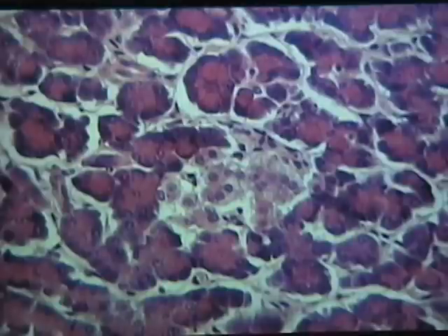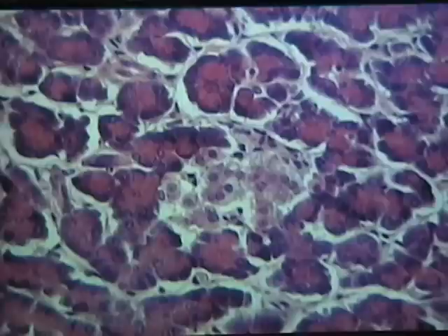This slide is taken from the pancreas. The pancreas does not fit the nomenclature of epithelial tissue. It actually belongs to an epithelial category known as glandular epithelium. The group glandular epithelial tissue would include all of the glands, and if this was a class in histology as opposed to a chapter in a textbook, we would cover most, if not all, of the glands. But I like to use the pancreas as an example of glandular epithelial tissue because it's very interesting.